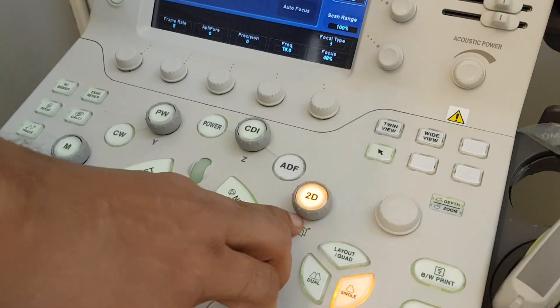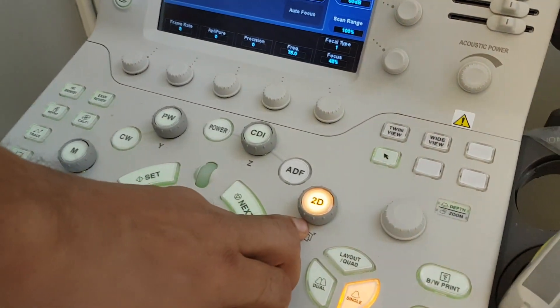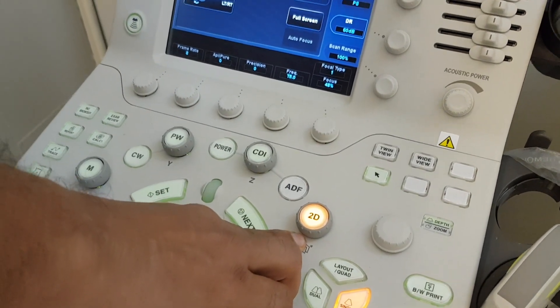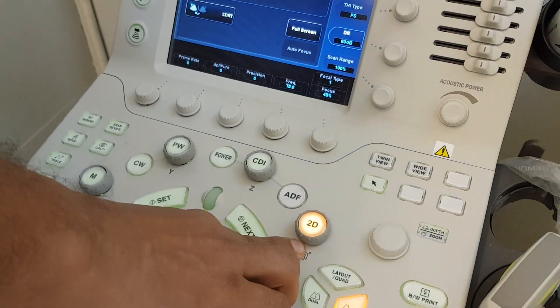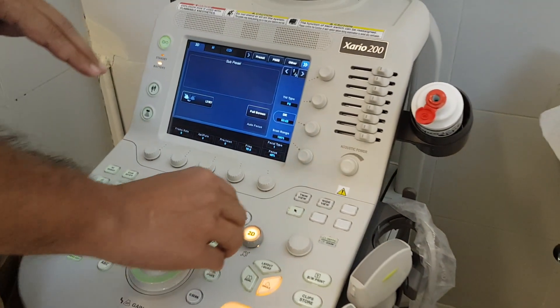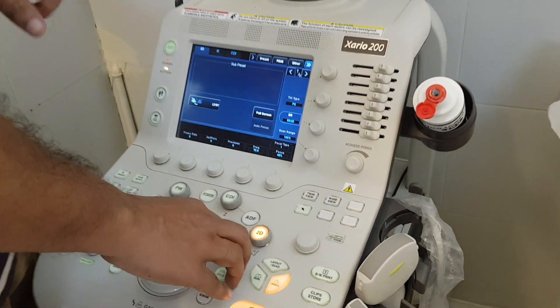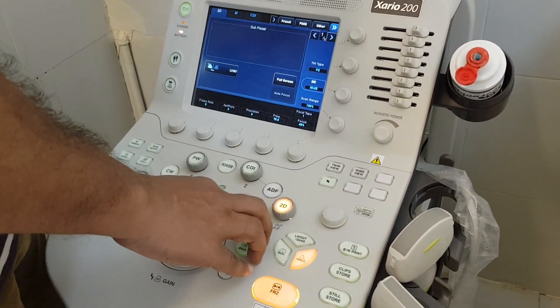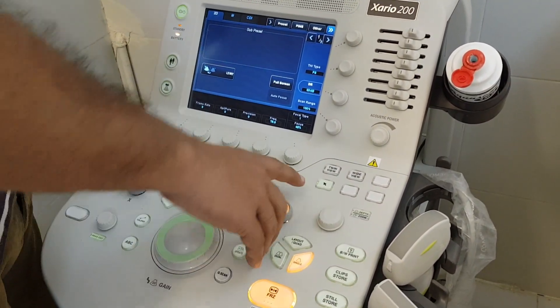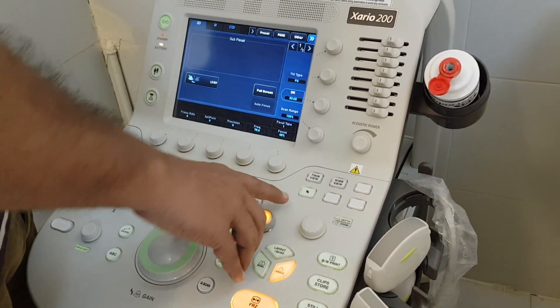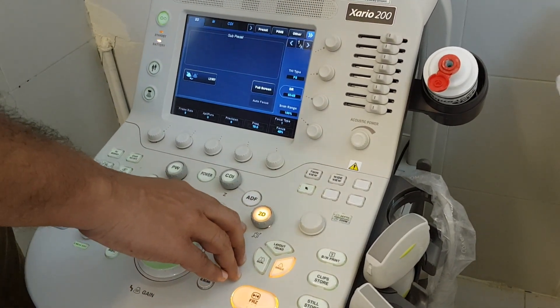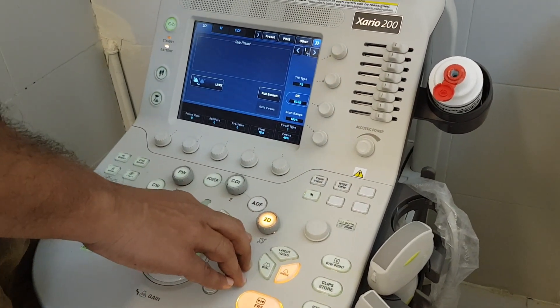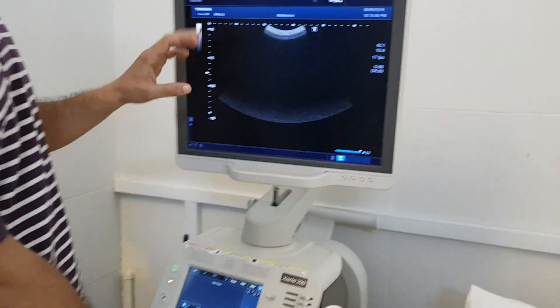The next important knob is 2D. 2D means this machine is a 2D ultrasound — it is not three-dimensional. Other machines have a 3D option with a 3D knob. Here, 2D means it is not Doppler active; it is a simple grayscale, two-dimensional ultrasound.